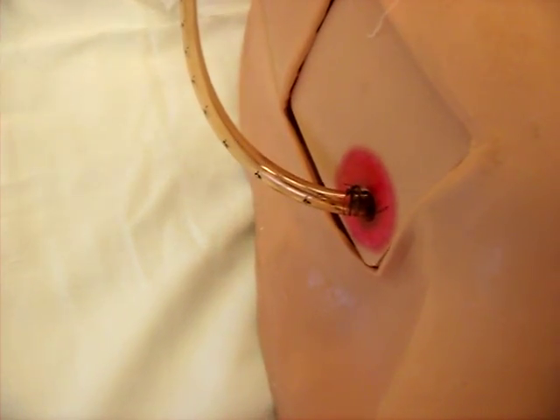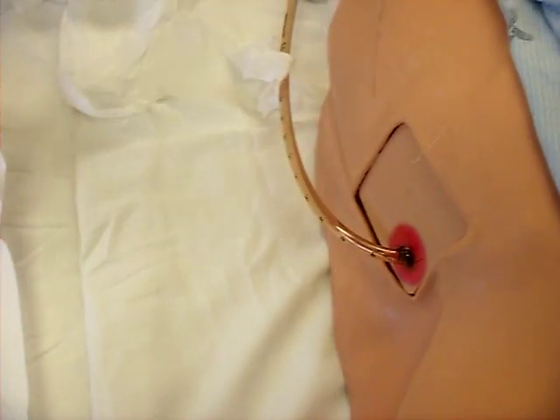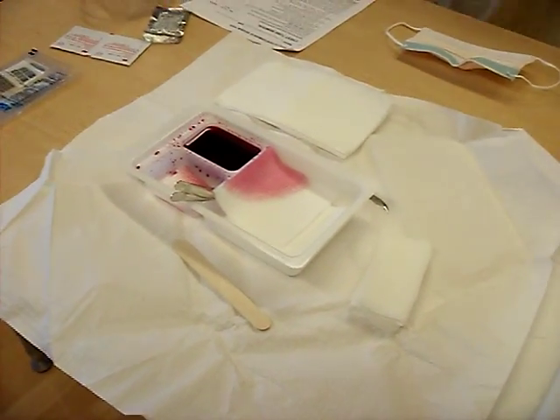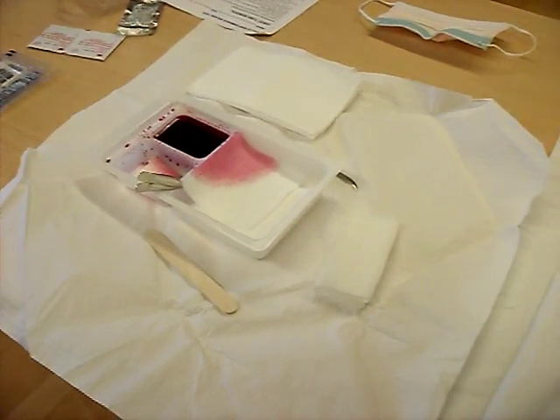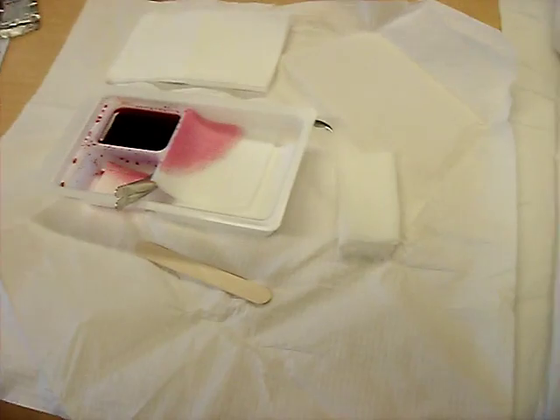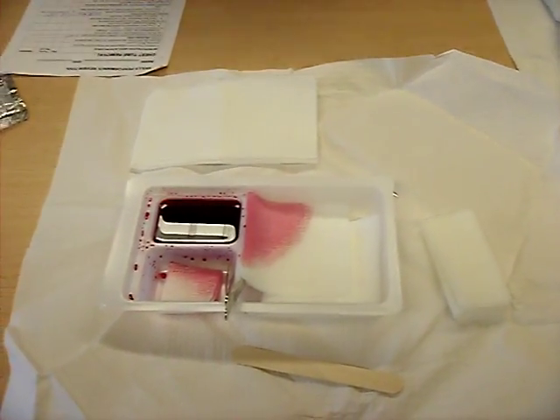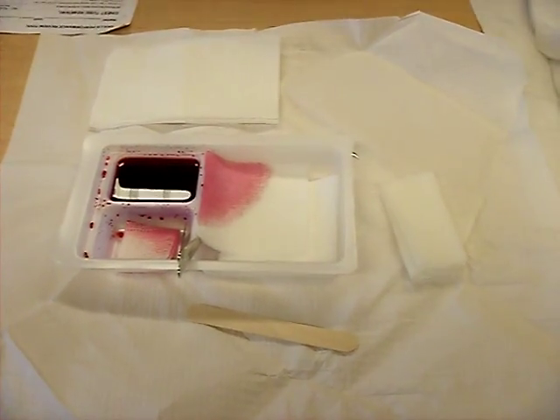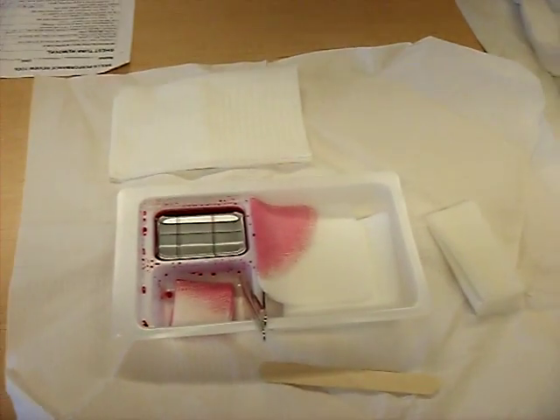Once you've done that, you're going to glove up for your sterile procedure, which involves removing your clean gloves, performing standard hand hygiene, which would be your Purell in this case, and donning your sterile gloves. Make sure that your sterile gloves are in a size that is comfortable for you. And this is a standard dressing tray over here. Please remember that you have to do that aseptically, and you will require a tongue depressor, some extra gauze, and a suture cutter.